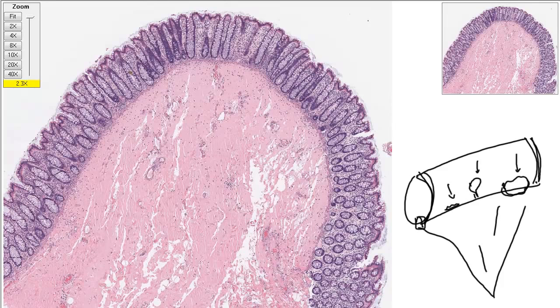I see. And so this is a cross-section crossing the boundary of the colon. So this area up top right here, this is literally the inside of the colon where, I don't know what the medical term for the poop is. Yeah, so stool. Yes, stool. Right. So much more authoritative. Yes. So that's the stool in the middle. Right. And then the supportive tissues are underneath. I see. This is essentially part of the structural tissue of the tube. Yeah, that's right. Okay. All right. So let's now drive around the slide.